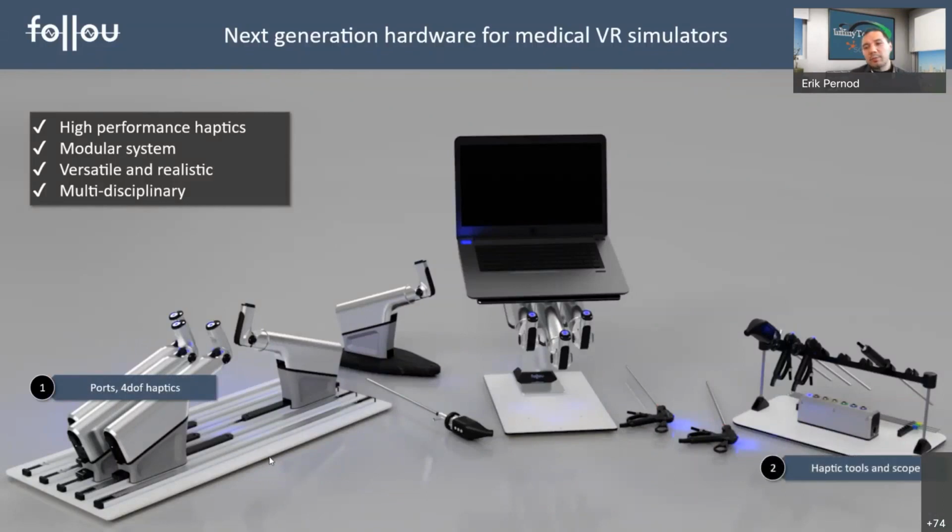It's a modular system where you can change the type of device. So it automatically detects the type of device you are using. This allows to create some very versatile and realistic simulation.